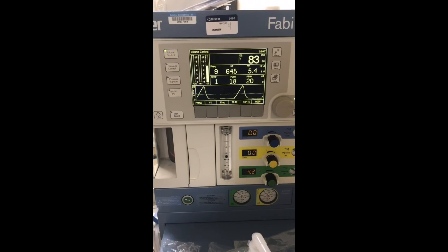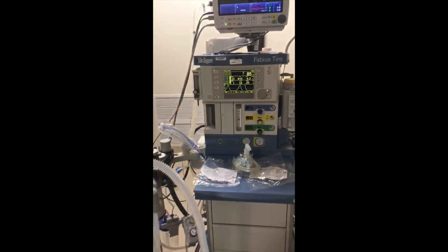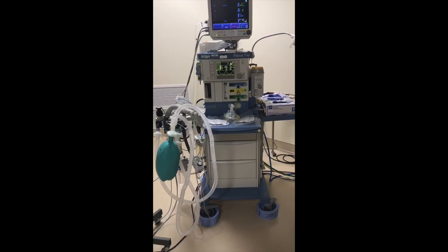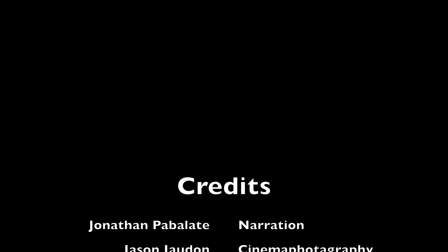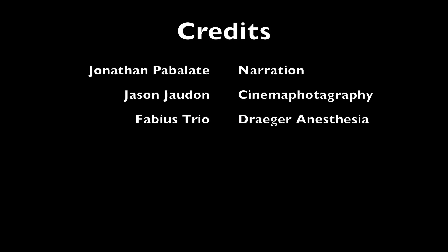So that's our Draeger demonstration. Hopefully you find that useful. The same would apply for the Apollo as well. Thank you.